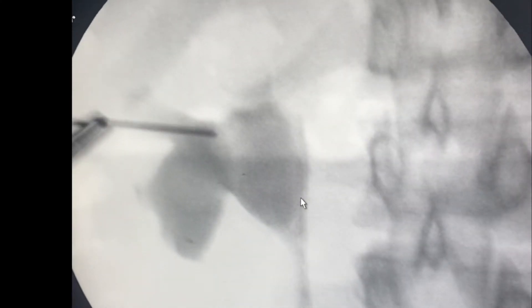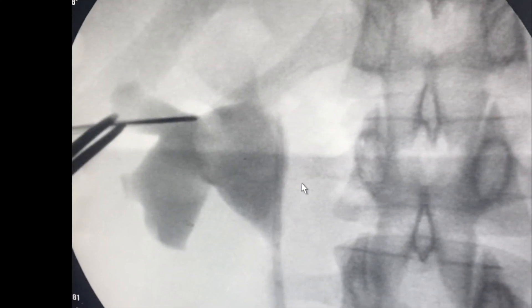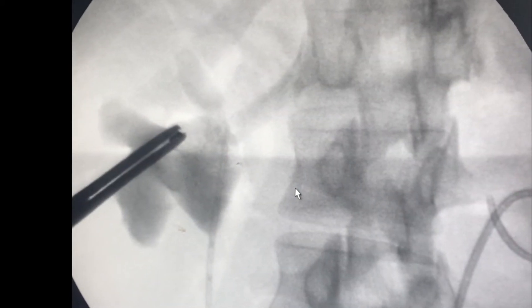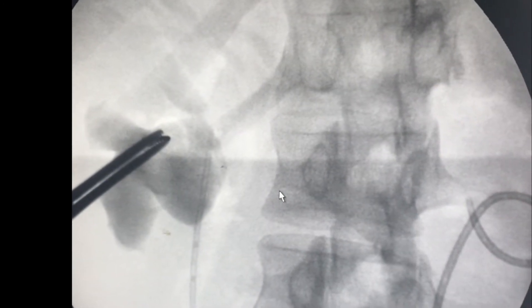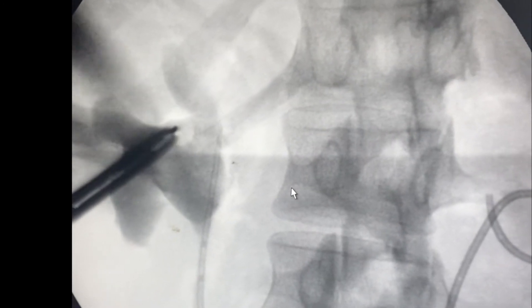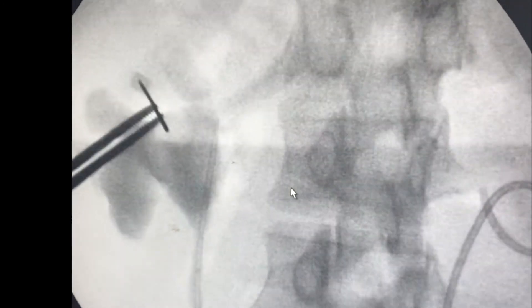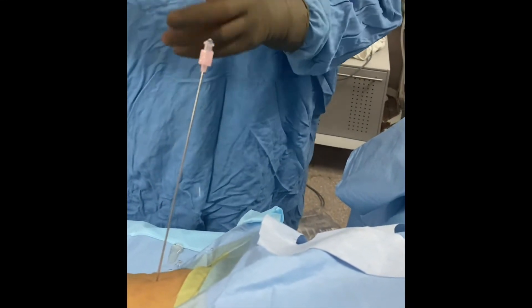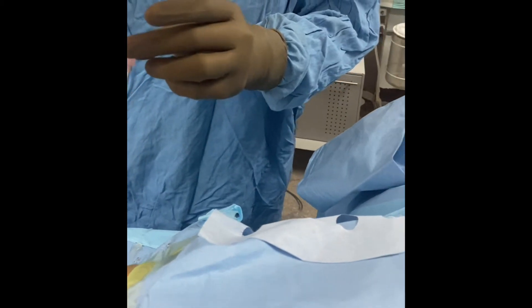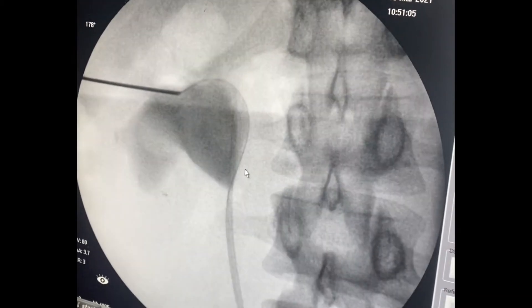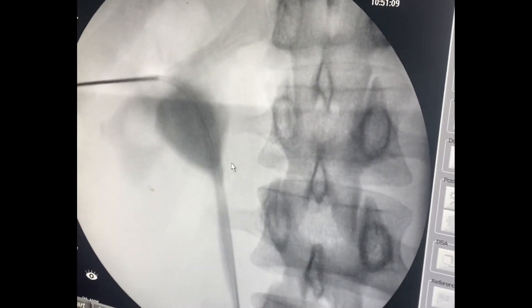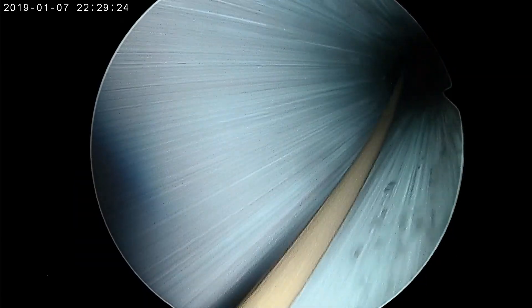Using a bull's-eye technique, the same calyx is targeted. At 30 degrees, the needle is aligned in line with the axis of the infundibulum. After aligning the needle, it is slowly advanced, and the depth is checked at 0 degrees. A clear reflux of saline confirms the needle position in the pelvicalyceal system. A guide wire passed through the mid posterior calyx goes directly into the ureter, as this forms a straight path to the PUJ.